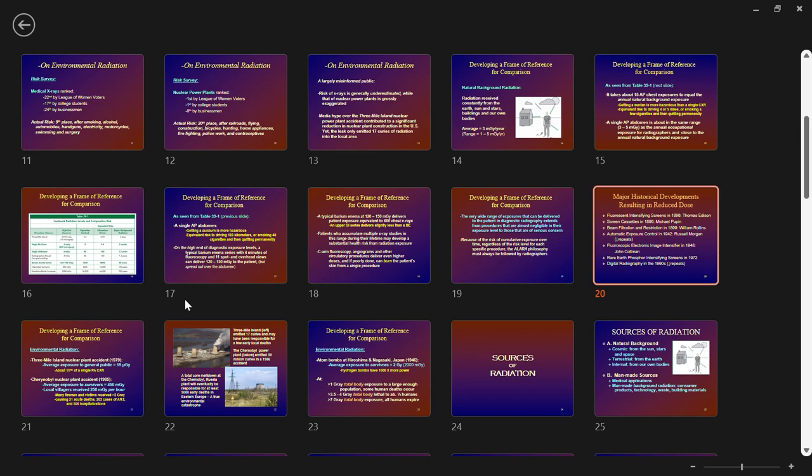Yeah, time, and then you got to make sure you have developer, you have fixer, you have a wash tank, right? These chemicals have to be in the right temperatures, in the right quantities. They have to be serviced regularly. Film had a lot of problems with it, but you still cannot achieve better resolution than film. Film has the best resolution of any type of imaging. It just happens that it's kind of getting phased out.